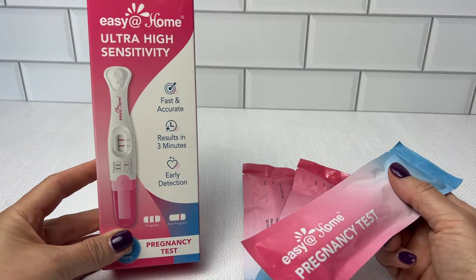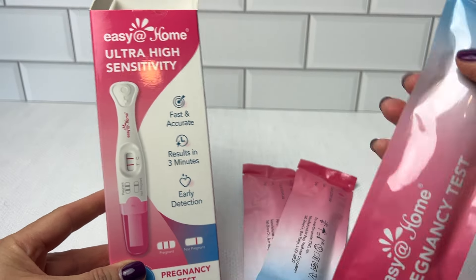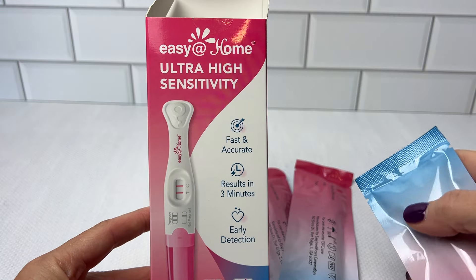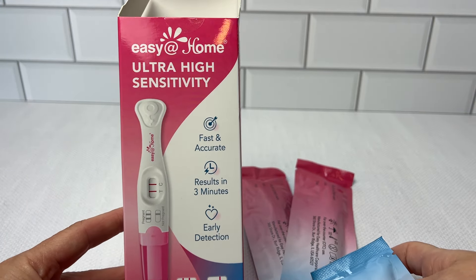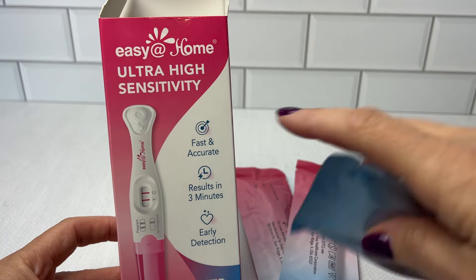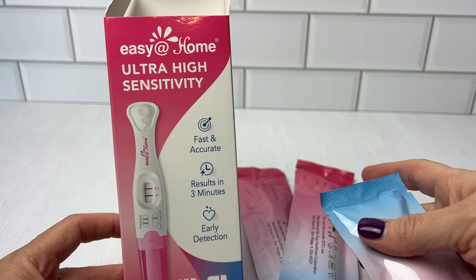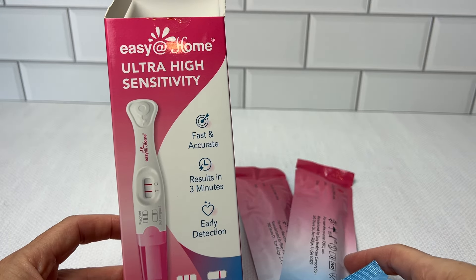One of the most impressive features about these pregnancy tests is the ultra-high sensitivity, detecting pregnancy even before your friend is due to arrive. I really like the ultra-high sensitivity because it's peace of mind on those anxious days before it's really that time of the month.